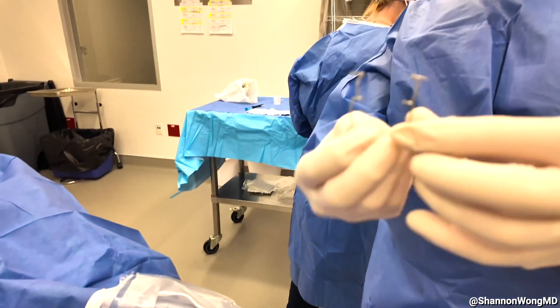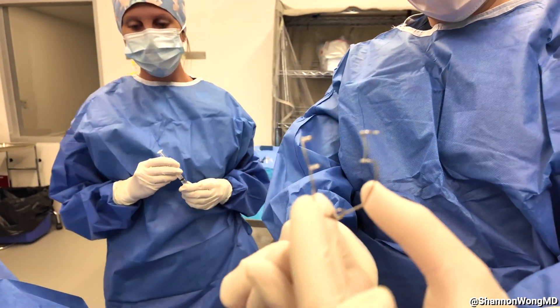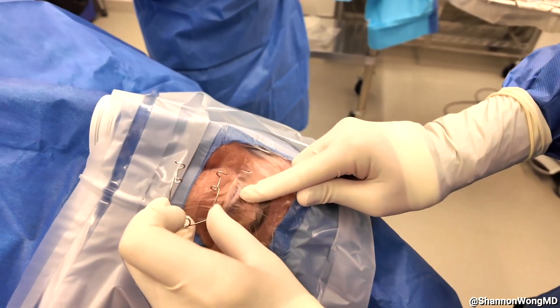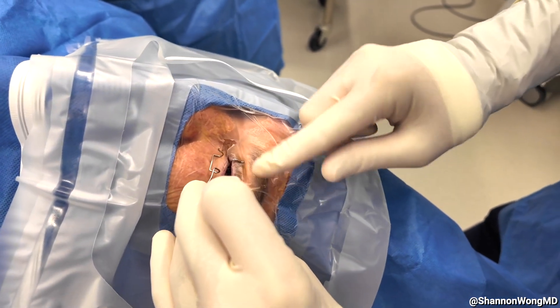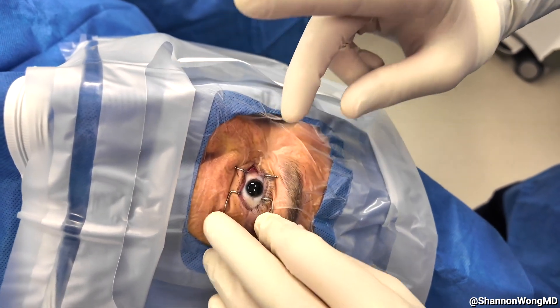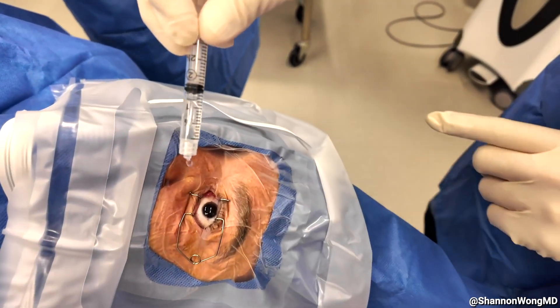This is our lid speculum. We first apply it to the upper eyelid, folding the upper shelf of plastic along the posterior aspect of the upper eyelid. Then the bottom of the speculum holds the lower eyelid, giving us great exposure. Then we apply additional anesthetic to keep the patient comfortable.